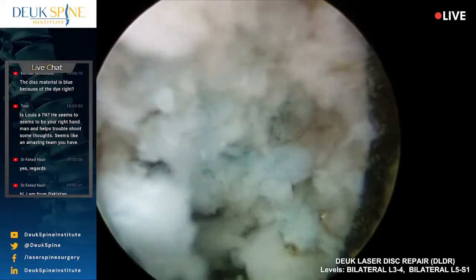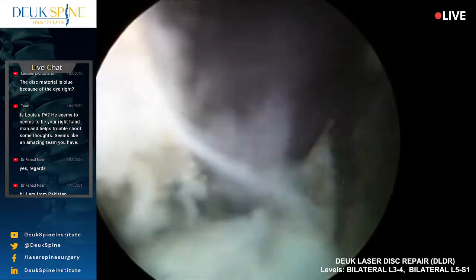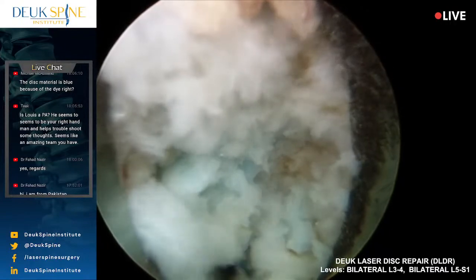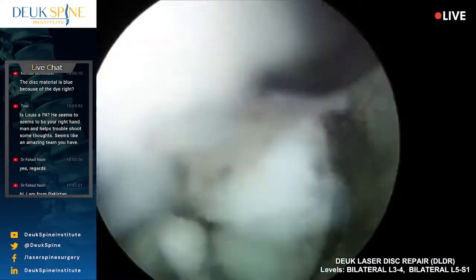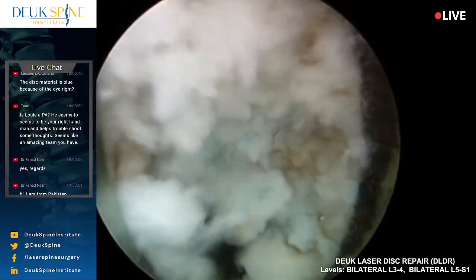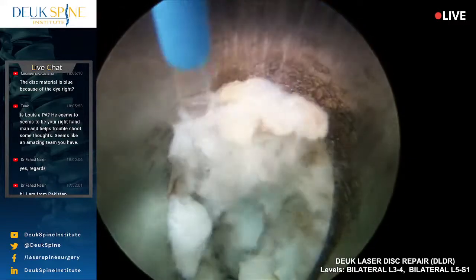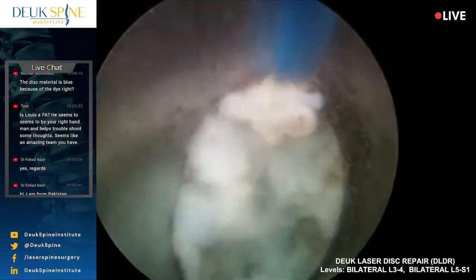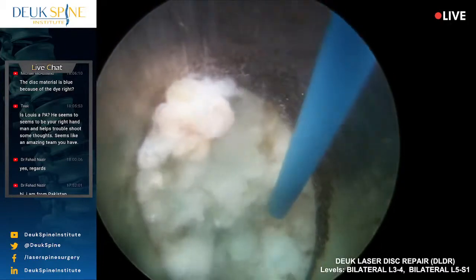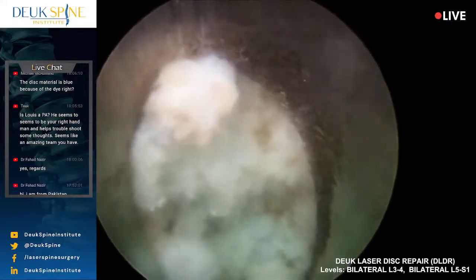Oh my God. This disc is the never-ending herniation. Honestly, I've never had so much, and you've got to grab quickly. It's just a quick grab, yeah. Take it. I'm going to be here till midnight if we don't get something done here. He's responding a little bit. Yeah, he's coming up.